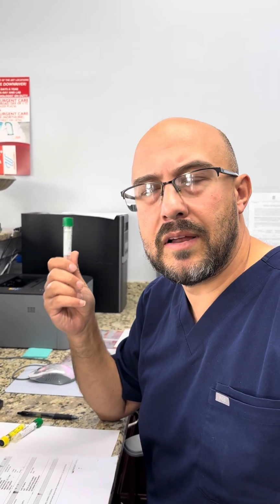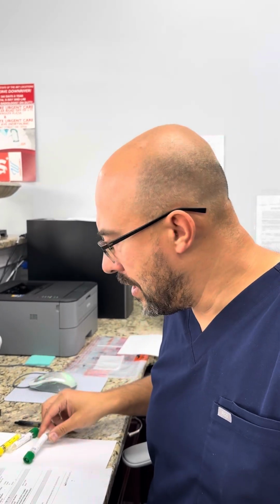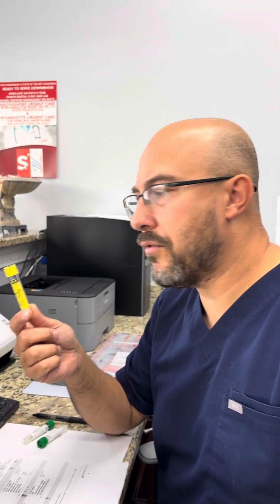And remember, these are universal e-swabs. They can also be used for like vaginal swabs, wounds. If the provider wants it, you can use these. And then also we'll be inputting the information for urine.